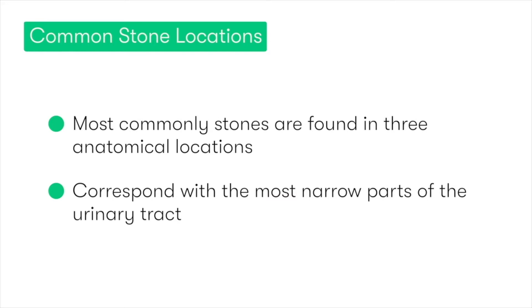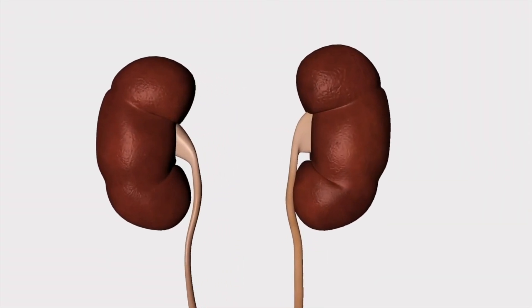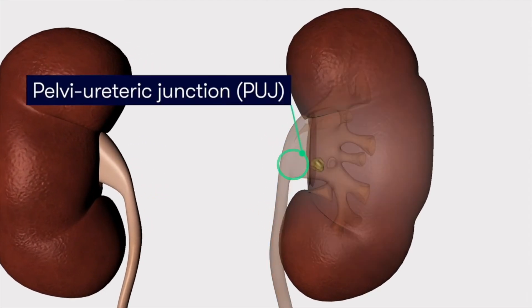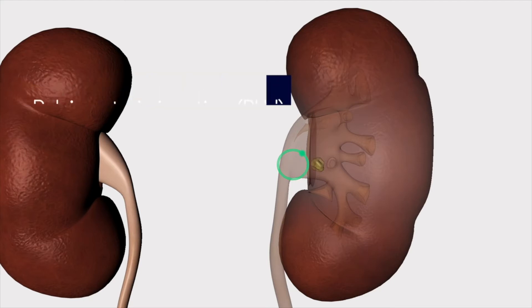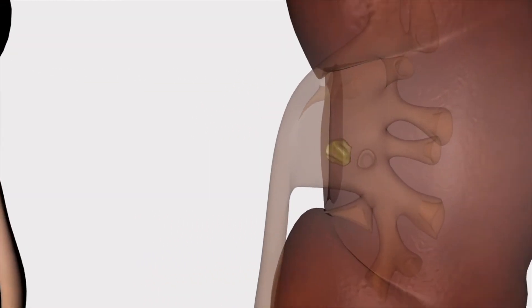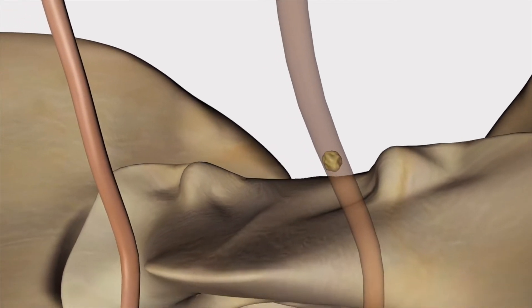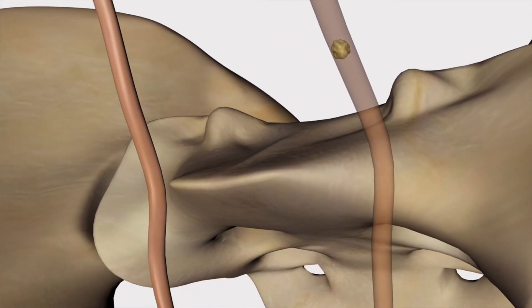Starting superiorly, the first location is the Pelvi-Ureteric Junction, or the PUJ, where the renal pelvis and the ureters meet. Then moving inferiorly, the next common location to find a stone is in the distal ureter at the point at which it narrows as it crosses the pelvic brim.